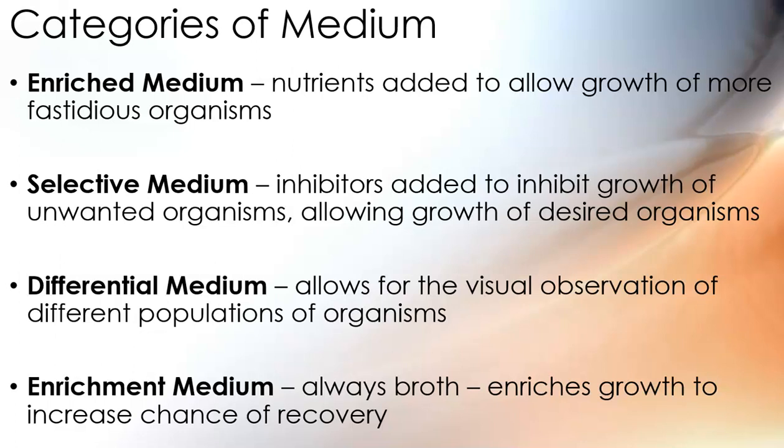Okay. Transport medium has just enough stuff in there to keep the critter alive, but not enough so that he's going to overgrow, multiply, start growing like crazy, right?